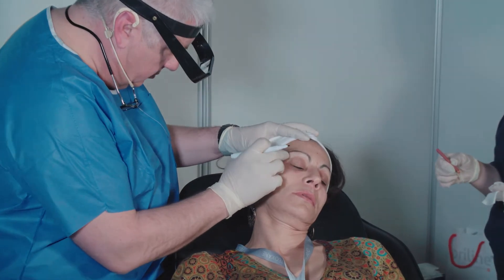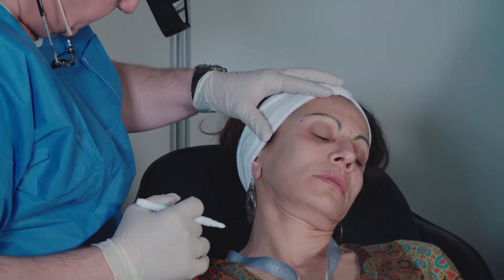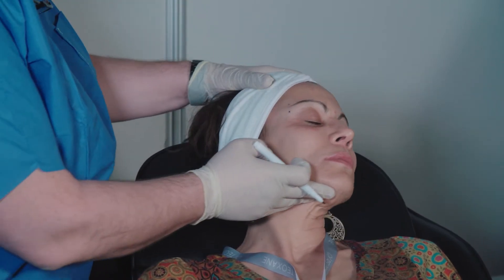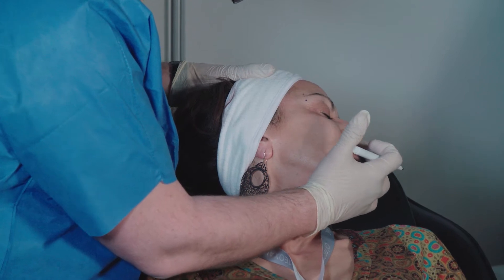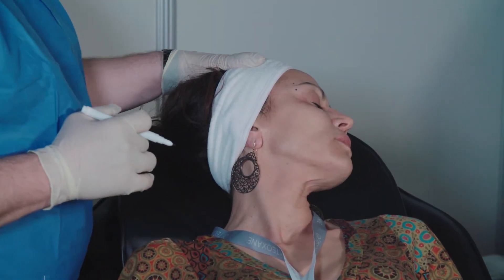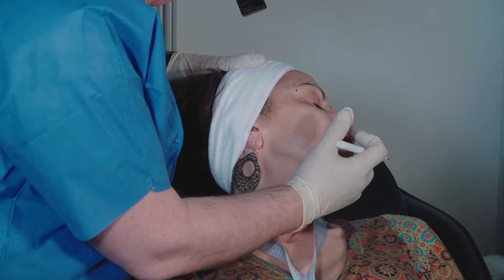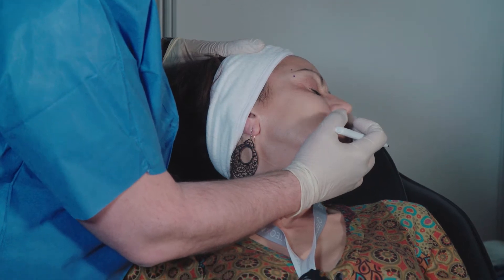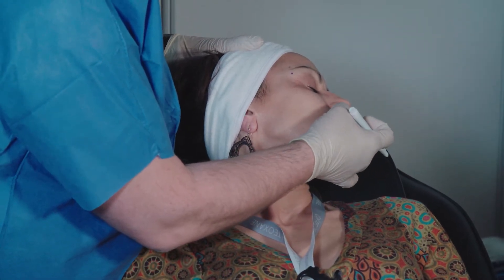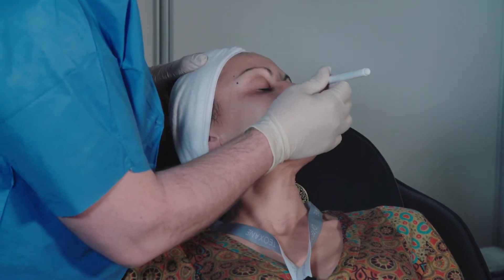We will inject the roof — the roof is the fat, the deep fat around the upper part of the orbital rim. And then if you see the profile of this patient, you'll see that there's no projection of the columellar area, and it seems that the columella is inside the nose. So we want to increase and obtain a better profile with a descending columellar area — I will do it with a tip approach.